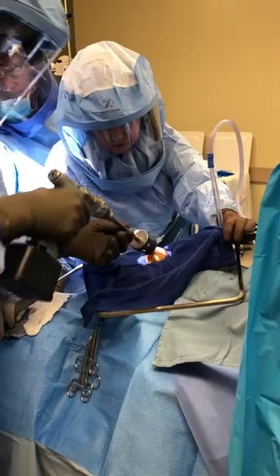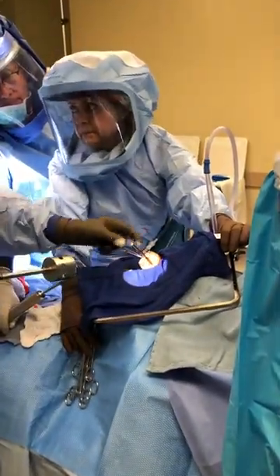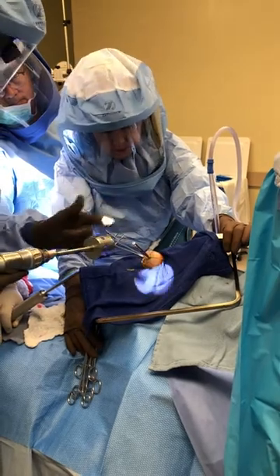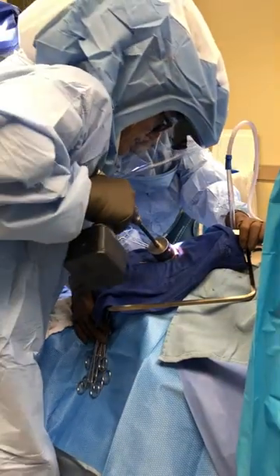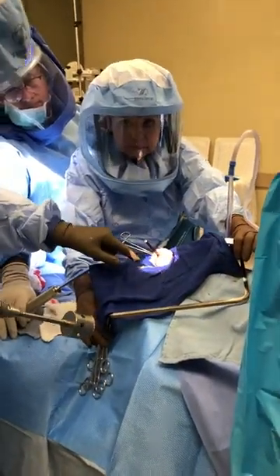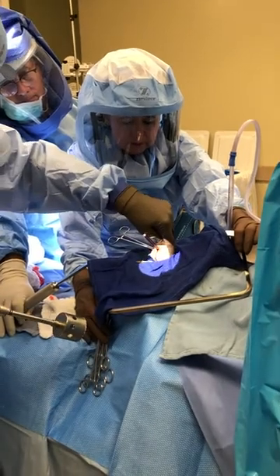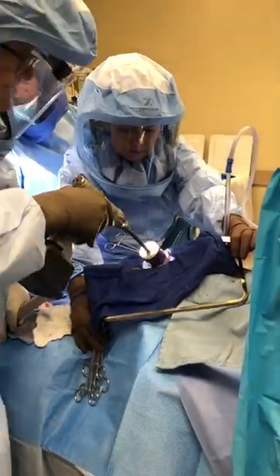Everything is color-coded, so this is the reamer for the 52, which is the double blue. Make the cut. So I have a stop, but I also pay attention to where my cut is, and obviously we can feel when the cut is going through. Let's take it off to show you that the cut is eccentric, superior to inferior.